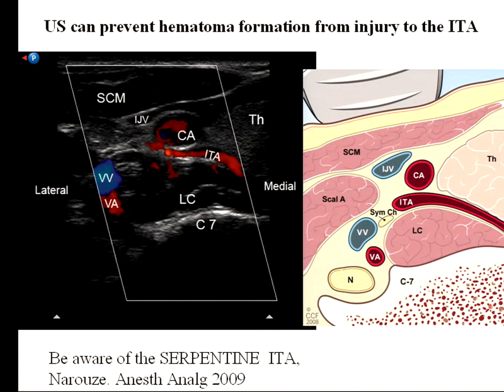The inferior thyroid artery, I always look for it to avoid it, because you can easily miss it. So I search for it first to see if it's at C6 level or C7 level, and then just skip it, scan up or down to avoid it. So this is C7 because the vertebral vessels are exposed. This is medial and lateral.